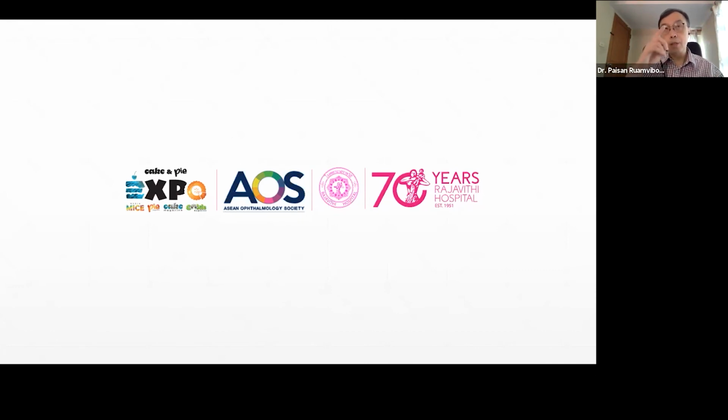You may face a problem of ungradable images, and how do you fit the AI into your current workflow? And the important thing is, you may need to have your AI approved by the FDA in your country before you deploy in the real world. So we proved that for retrospective study it works, and prospective study it still works, but for real world study we need another proof.